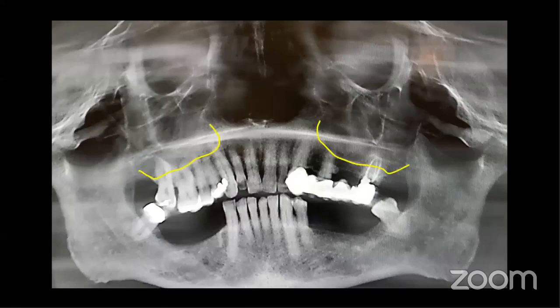So if we look at this particular case, we can see that the patient has sinuses that come pretty far anteriorly. Anytime I see a sinus that comes beyond the canines, that gets me thinking to alternatives. It gets me thinking to pterygoids. It gets me thinking to zygomas because, with the typical case, our sinus is extending to the premolar area. When it starts extending to the canines or even anterior to the canines, then we know that's limiting the bone that we have to engage with our implants for an all-on-four style surgery. Because you've got to remember, when we're taking these teeth out, we're going to be reducing this bone. Well, you should be reducing bone. Now, I can tell you, a lot of people that are doing these procedures are not reducing bone, and it causes a lot of problems.